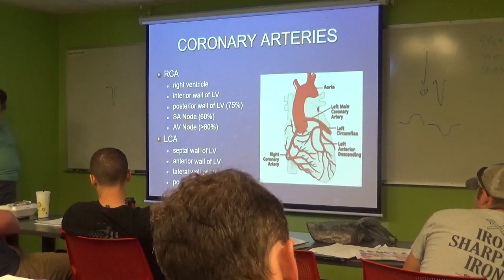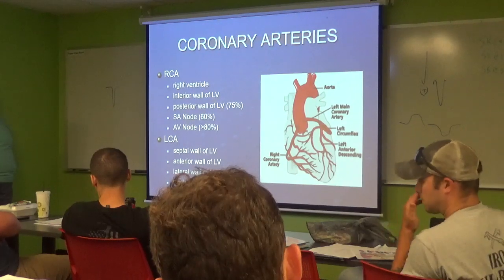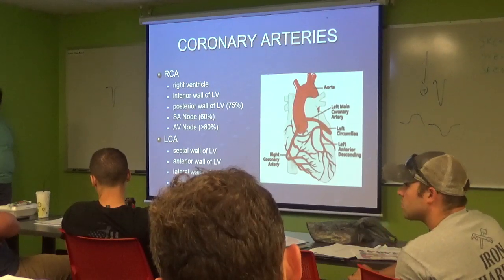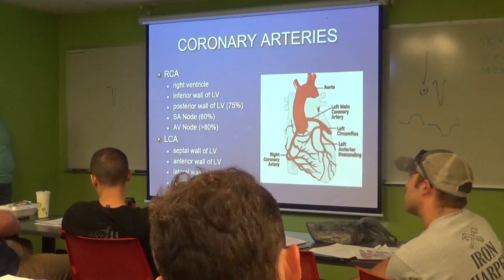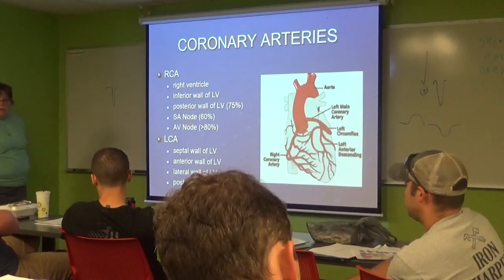Why do we do a V4R? Somebody else besides him? Why? To see if there's right side of the heart involvement. So why do I care that I see the right side of the heart? That's where the damage is.